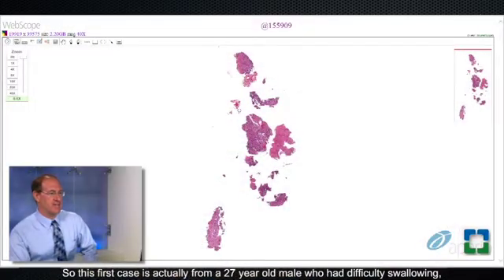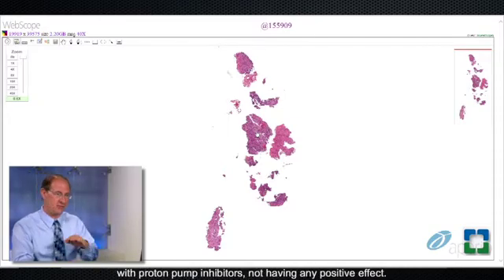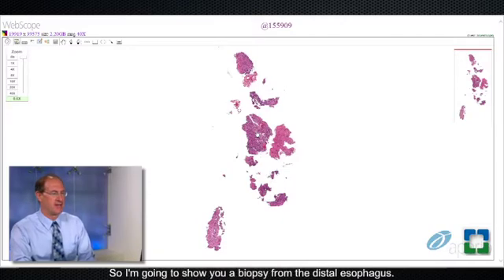This first case is from a 27-year-old male who had difficulty swallowing, some dysphagia. He eventually came to endoscopy after being treated with proton pump inhibitors without any positive effect. I'm going to show you a biopsy from the distal esophagus.